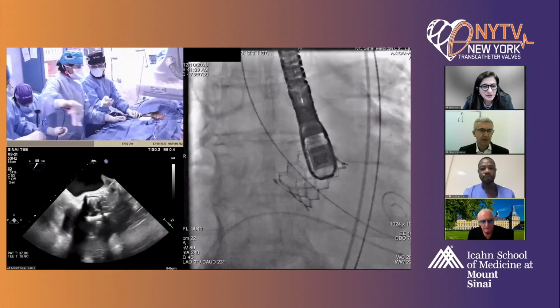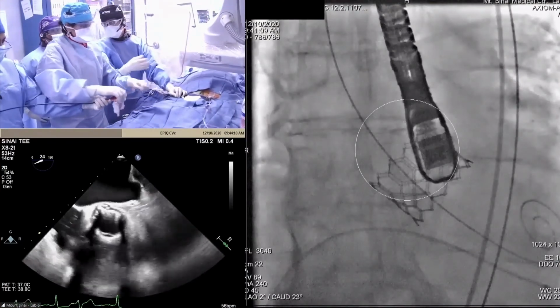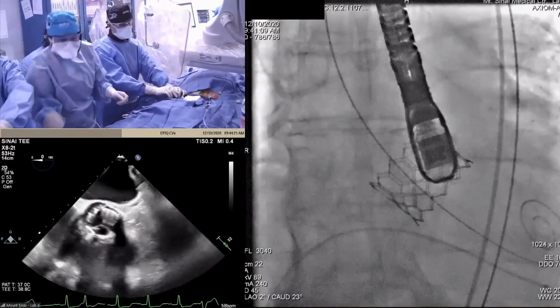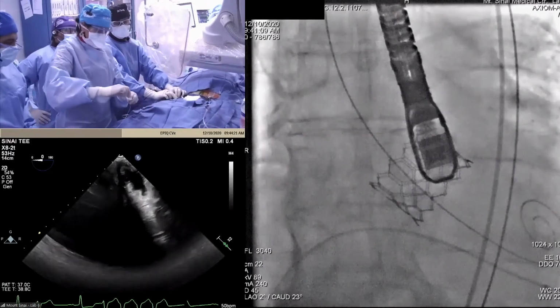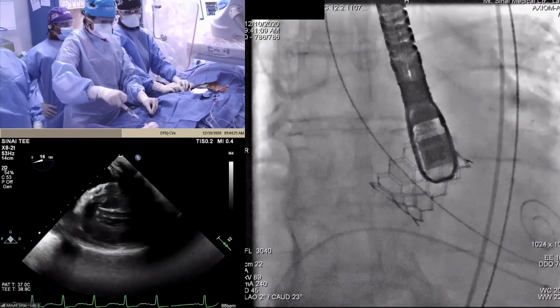Okay, we'll do the aortogram. We'll put a pigtail in first, Dr. Sharma. Gilbert, you agree with that? Yep. So Didier, we actually look at the supraannular aspect of it. I mean, because of dilated root, we know that it's going to be larger than the mean diameter that you measure at the annulus.